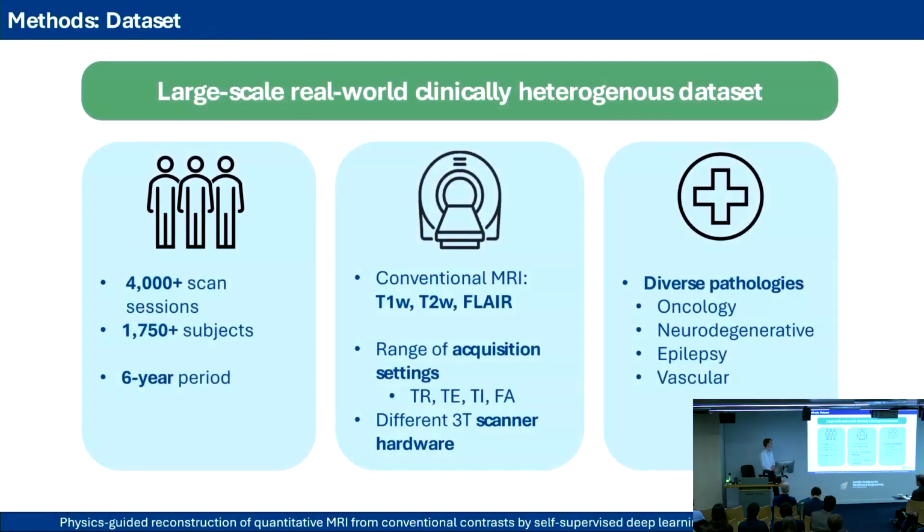So now, first to the method. So shortly the data set. So we collected a real-world clinically heterogeneous data set at our University Medical Center from our radiology department. So we have over 4,000 scan sessions from almost 2,000 subjects, obtained over a 6-year period.